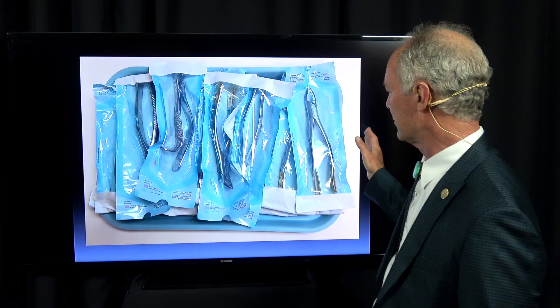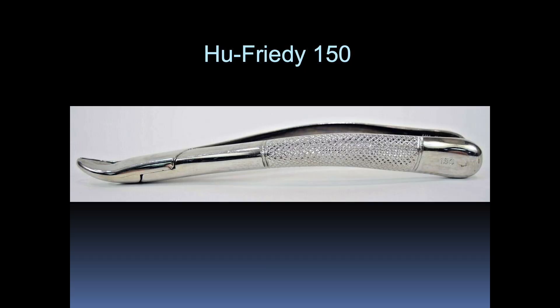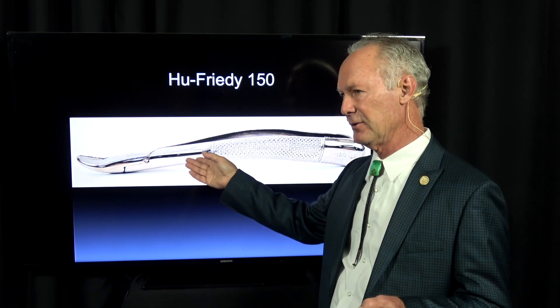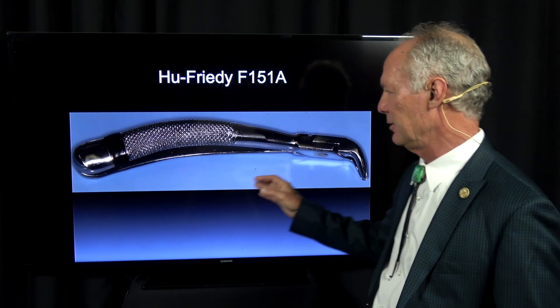And then these are my extraction forceps. Hue Friedy 150 — I use this for extracting maxillary teeth. You can extract any maxillary tooth with a 150. This is a 151A — you can extract any mandibular tooth with a 151.